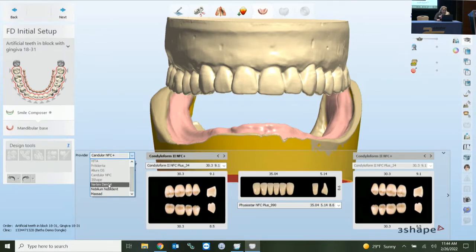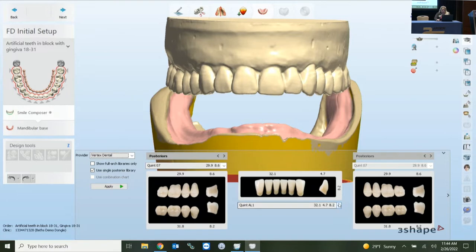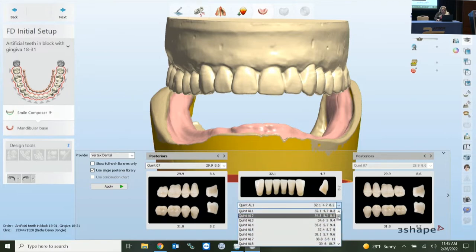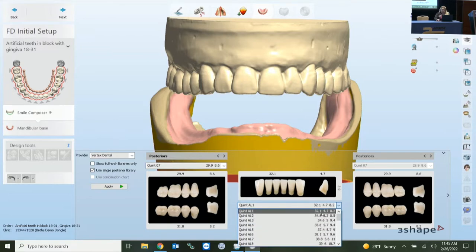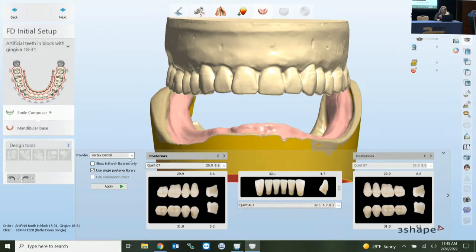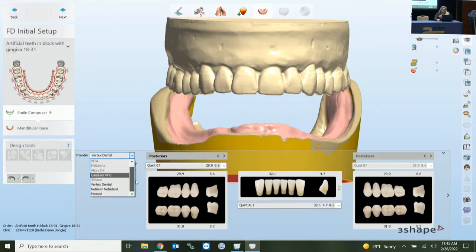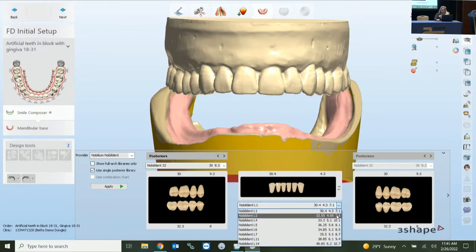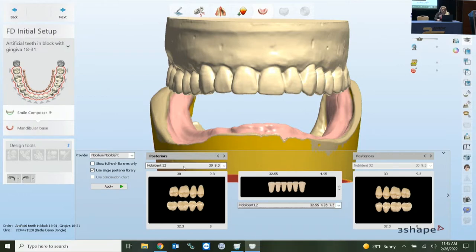On the left, we'll choose Vertex as an example. Dropping down the library, you can see several options. The numbers give you the span of each section — the size, depth, and height of the tooth. Based on the mouth you're working on, you can choose different parameters. Different libraries offer different options; for example Nobilium has an extensive library. Depending on the library chosen, there's also tapering, square, and ovoid tooth forms.